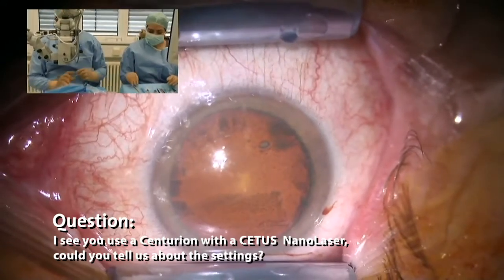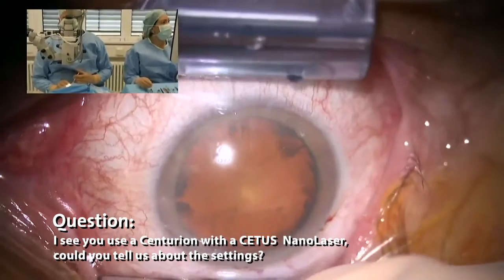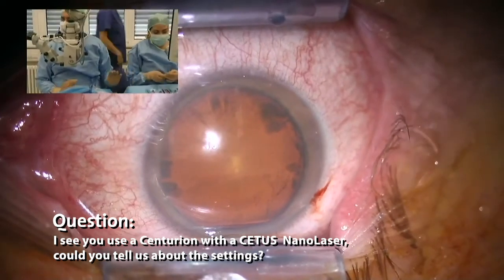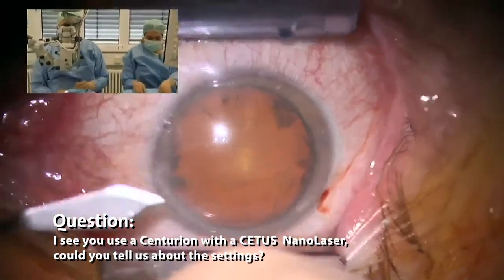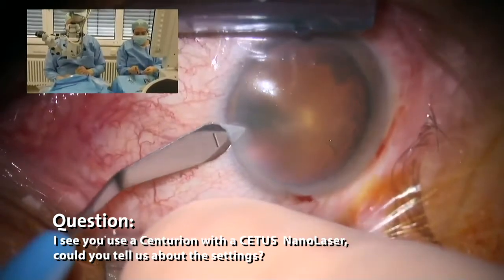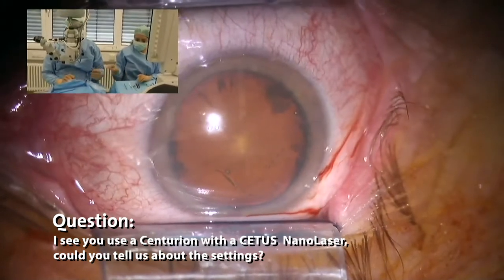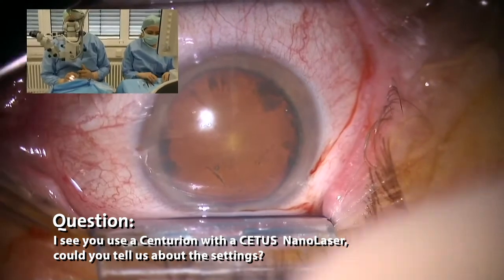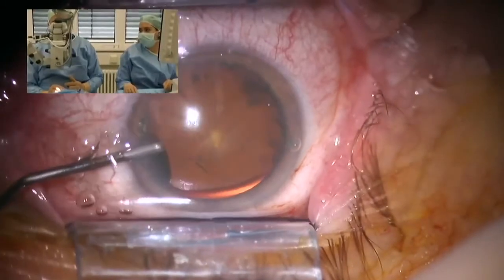So I see you use a Centurion vision system with your CETUS Nano system. Could you tell us about the settings? So you see that we combine the nano laser with the Centurion, and the fluidics come from the phaco machine. And the Centurion is, let's say, a Venturi-like peristaltic system. I hope the Icon guys don't get mad at me when I explain it like this.